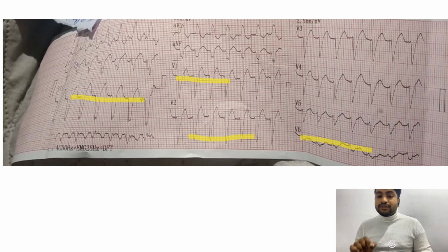I am again trying to insist on this point. Whenever you come across this kind of ECG, you should always look for the P waves and try to differentiate fast left bundle branch block from VT. All right. Can anybody tell me in the comments below what the axis is on this ECG? Comment it down below and I will tell you if you're right or wrong.